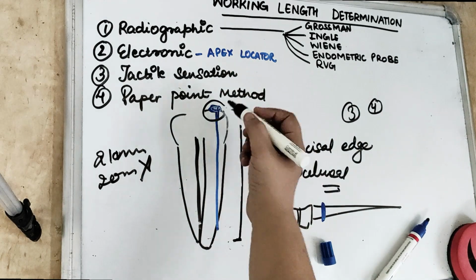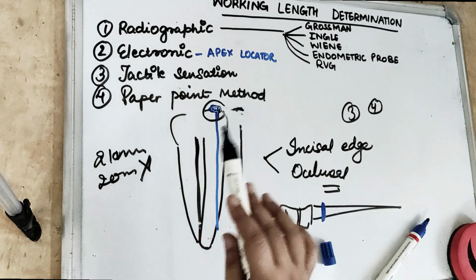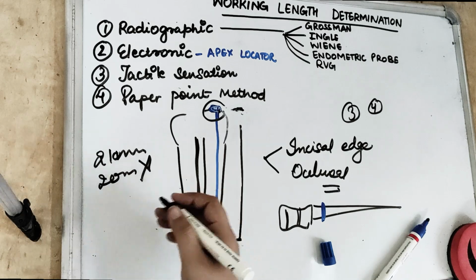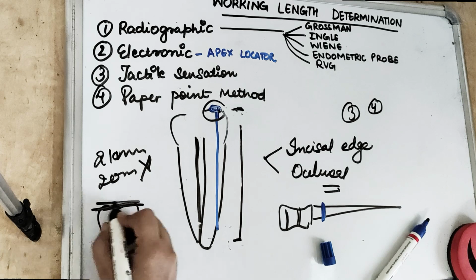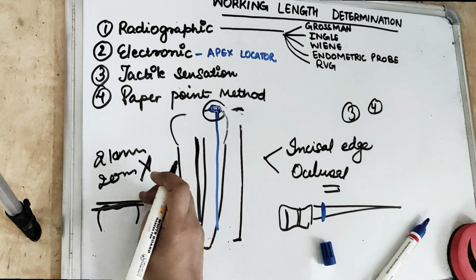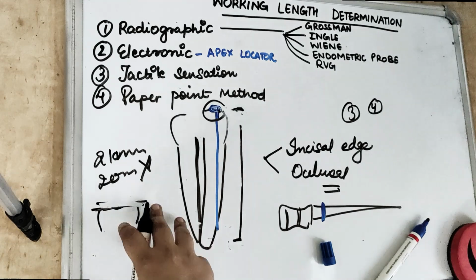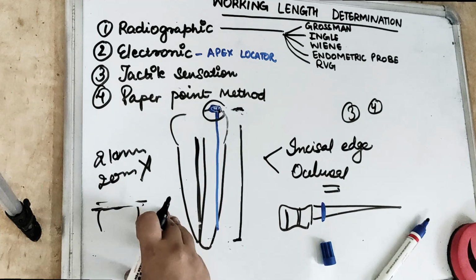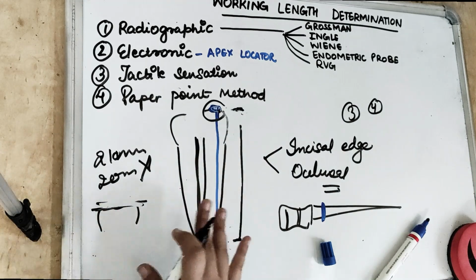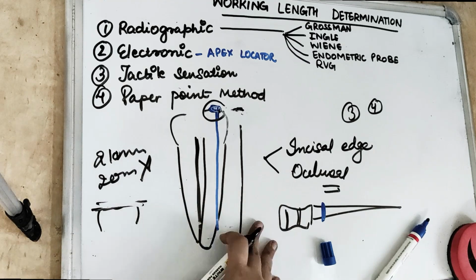So this is the highest point on the incisal or the occlusal surfaces, and this is the reason why, while doing root canal treatment, before itself we relieve the tooth. The occlusal reduction is the first thing which we do. So we relieve the teeth occlusally and then we start doing the preparation. So stability is important: it is important that this reference point is not changing during or between any appointments of the root canal treatment.